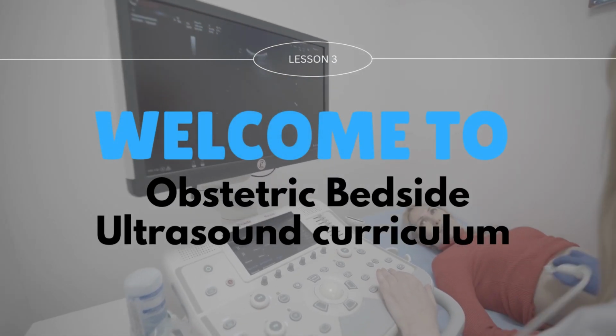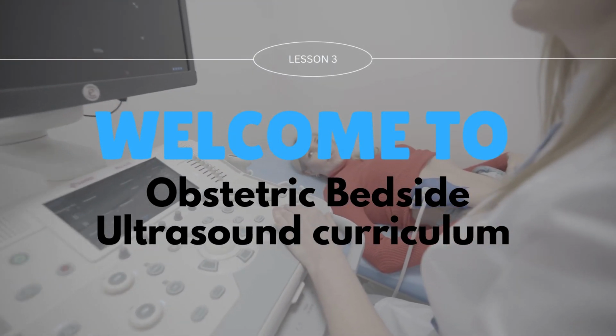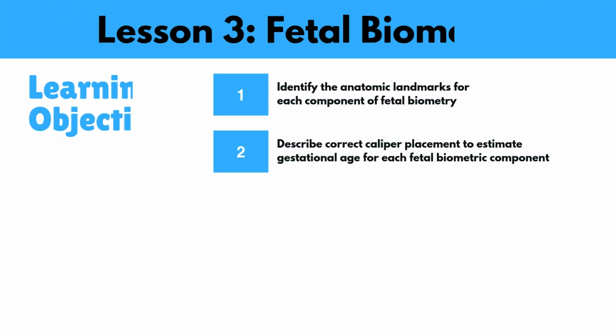Welcome to our Obstetric Bedside Ultrasound curriculum. We've collected some of our favorite videos about fetal biometry. Learning objective number 1 is to identify the anatomic landmarks necessary for correctly measuring fetal biometry.